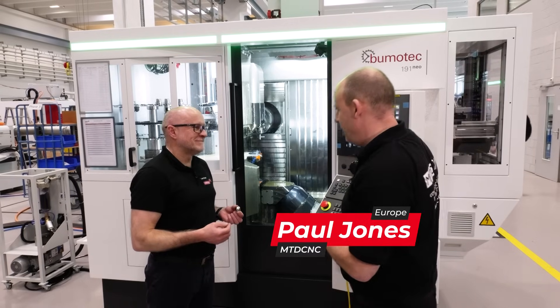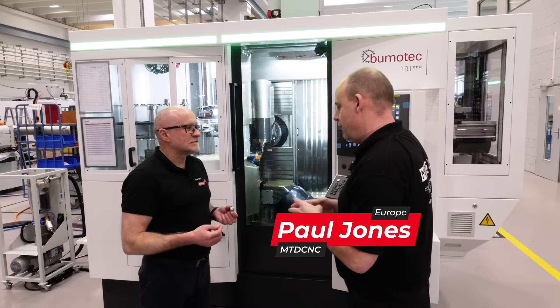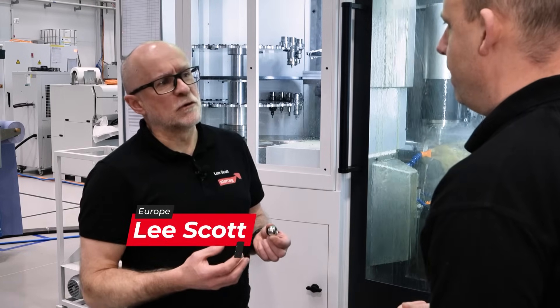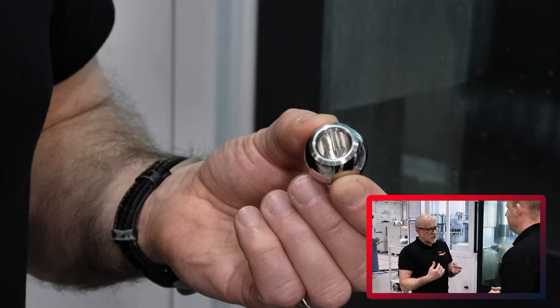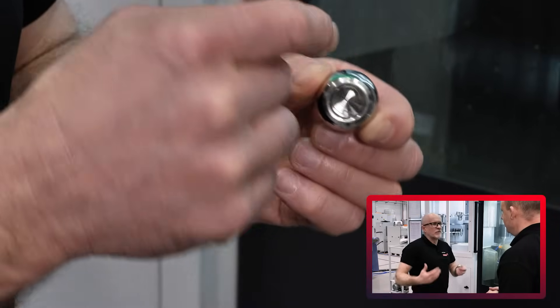Now Lee, that's a shiny ball you've got in your hand here, and I know you personally were involved in the development of this project. What is the part? It's a femoral head, or a femoral ball. Where's that going? It could go to your shoulder or your hip — the ball fits onto a stem and then is fitted into the body.